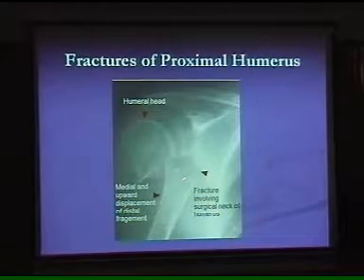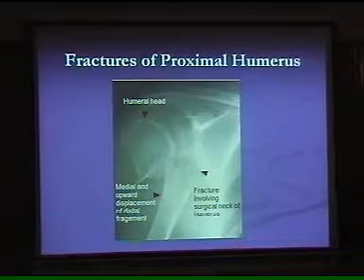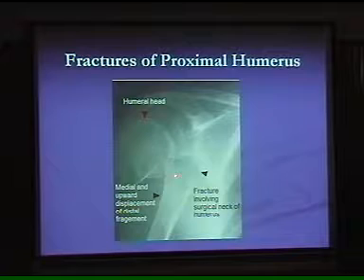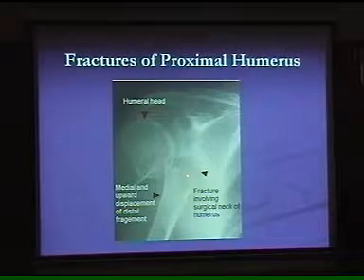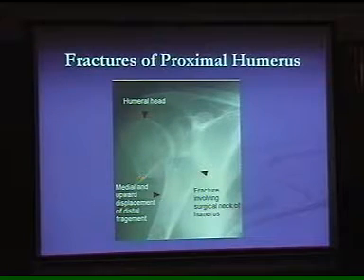The cortex is okay, the density, the trabecular plate is okay, because sometimes these may be pathological fractures. If there is metastatic disease over here or any disease over here, the disease may not be evident until there is a fracture. So the history of the patient is very much important. You can appreciate that.